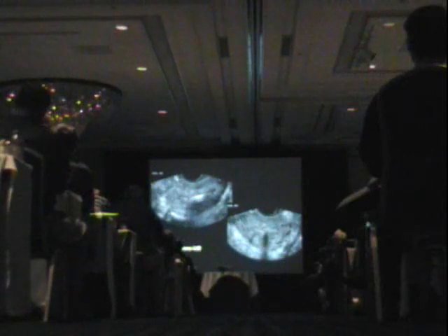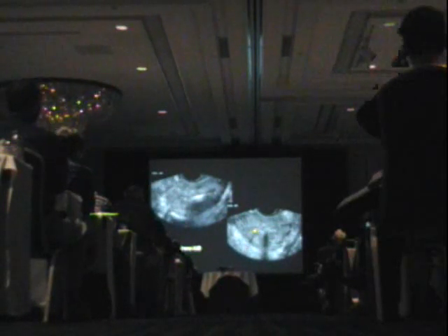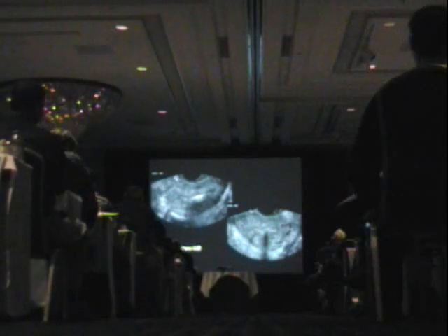But when you turn transversely on it, or coronal, to see up at the top, you see there's some shadowing here, but it's extremely subtle to look for the little shadowing part off here from one end of the T, and maybe a little shadowing from the other end of the T. So it can be extremely difficult to see Mirena IUDs.